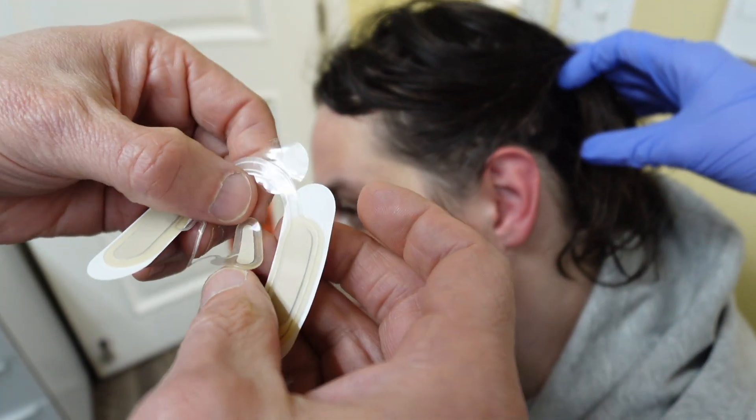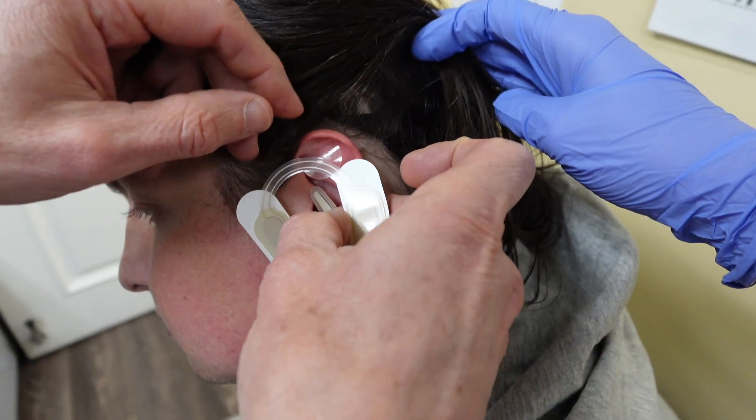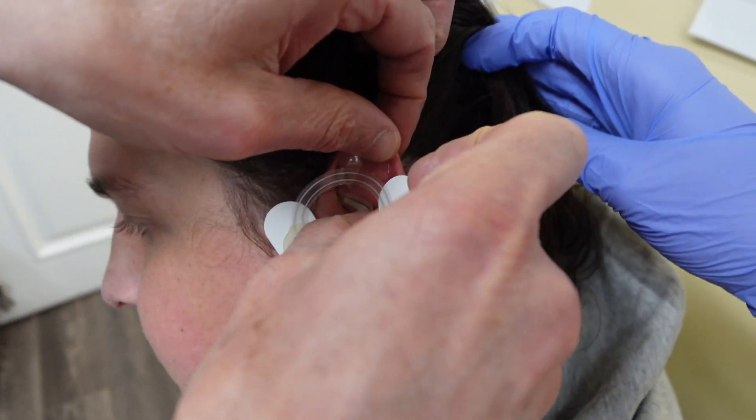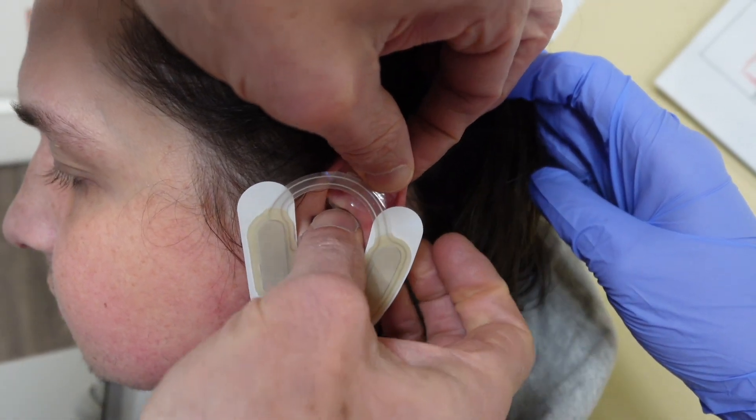This is better than the Bridge device. Number one, you can wear this as many days as you need. The Bridge device was a throwaway five-day device. With this, you can control the amount of stimulation, which is great.